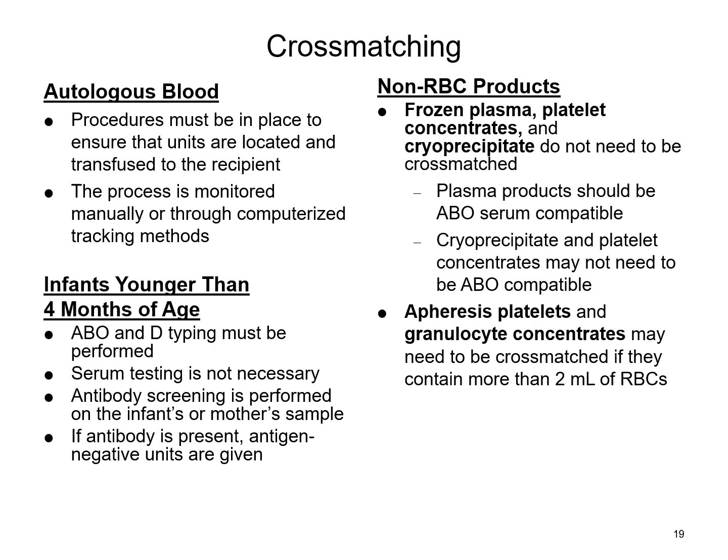You have situations now where children are being adopted or being raised by aunts and uncles or other family members, grandparents. So be very specific that that sample has to come from the birth mother, the biological birth mother. If an antibody is present, then of course you will give antigen negative units honoring that particular antibody. More than likely it is mom's antibody, although you may have some situations where babies have started developing their own.